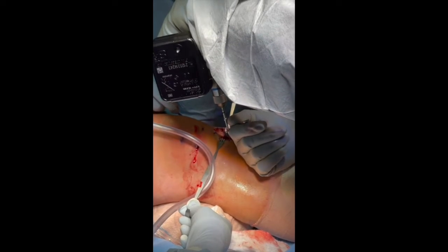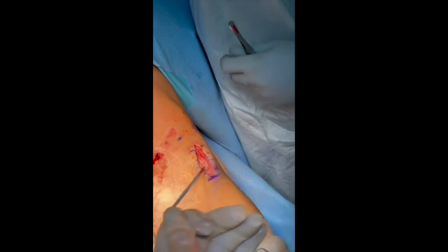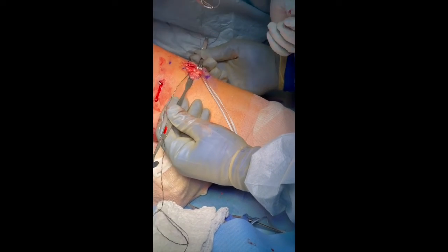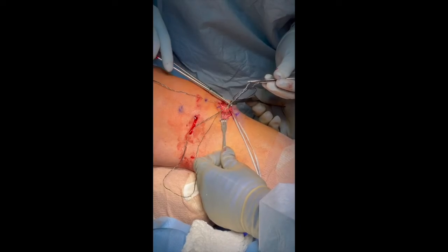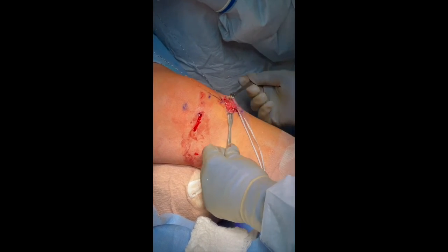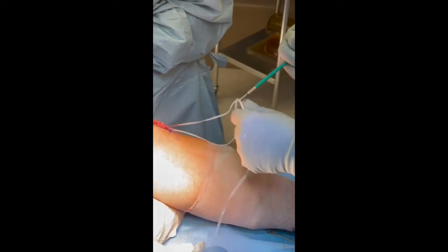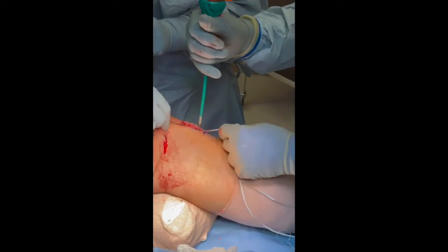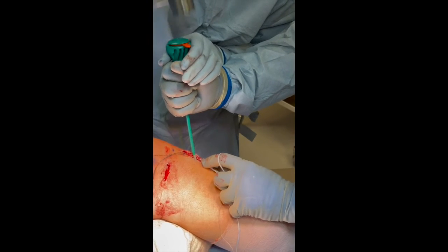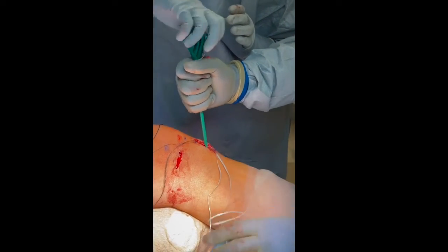Two Arthrex fiber tape sutures are used in a horizontal mattress fashion to repair the patellar tendon side-to-side. Two Arthrex 4.75mm peak swivel lock anchors are then placed into the bed of the bleeding bone, using two sutures to repair the central aspect of the tendon back down to the tibial tubercle.